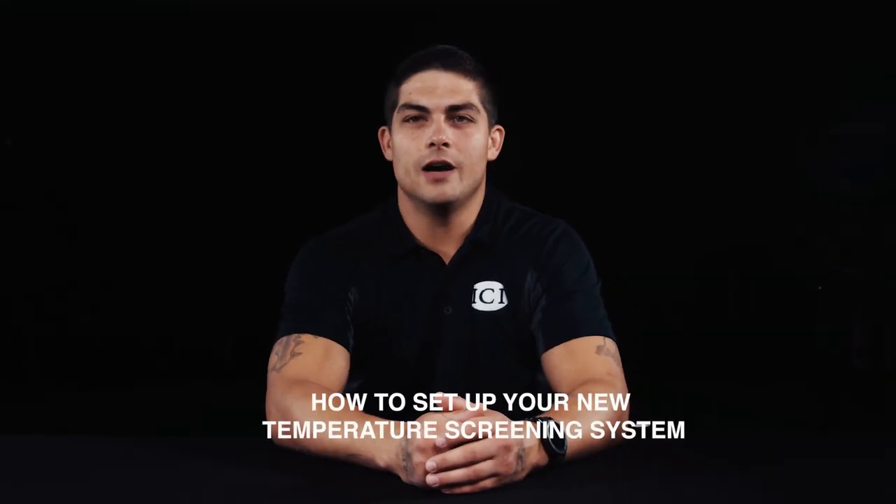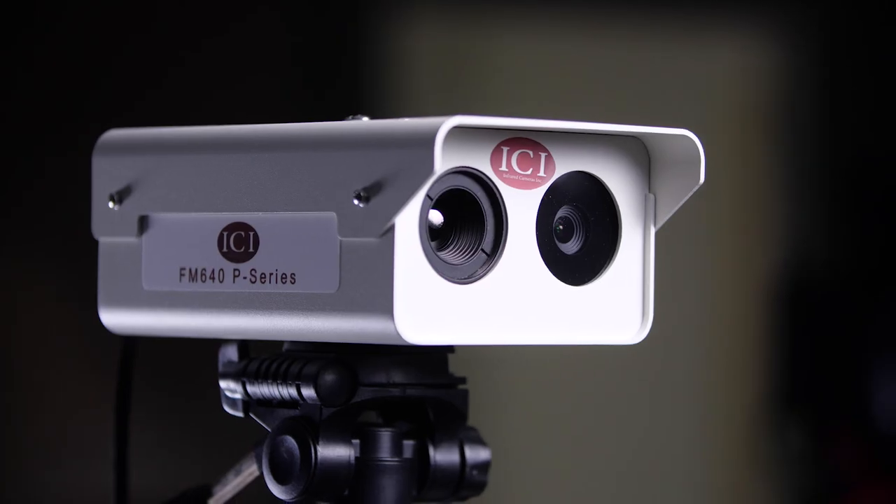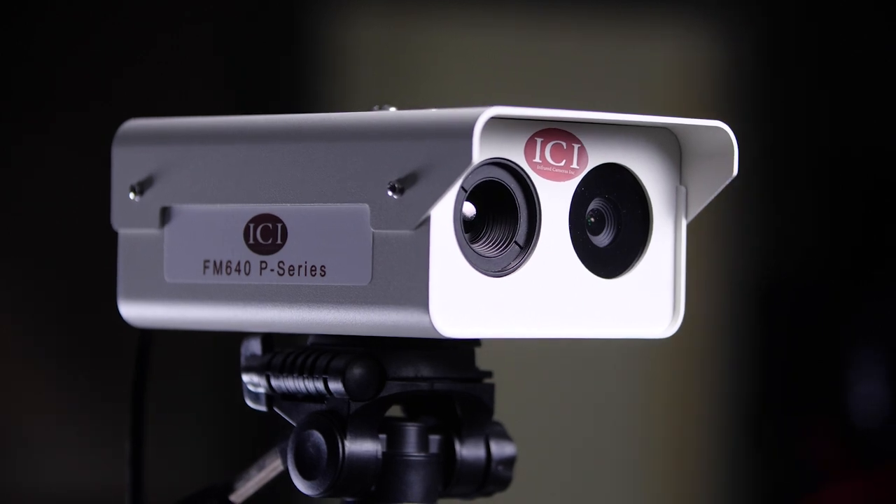Hi and welcome to ICI's video on how to set up your new temperature screening system. Today we will start by unboxing and identifying each of the infrared temperature screening components. At the end of this video you will be able to properly install your new system for a successful temperature screening process.